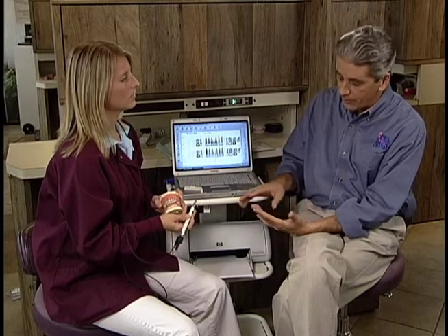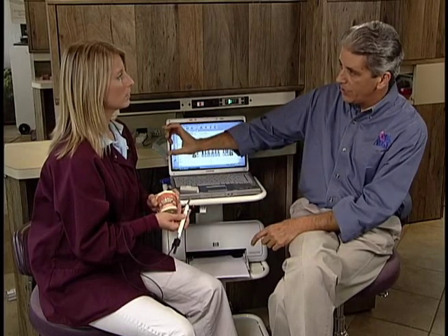Let's talk about one last thing while we're still within pocket depth. The 3 important factors relative to patient comfort. The first one is bent or kinked tip. Make sure it's free floating. I might want to check that during the exam. If something feels a little different in my hand, I might want to check that. A good technique is to keep a cup of minty mouthwash in your tray setup. It's a good lubricant. Sometimes saliva, blood can dry on that and impede the travel of it. So a minty mouthwash in your tray setup.